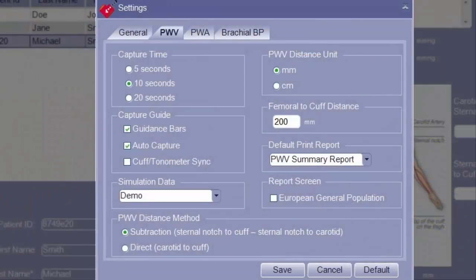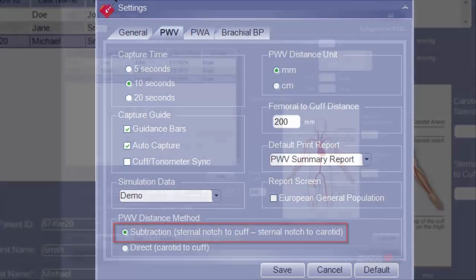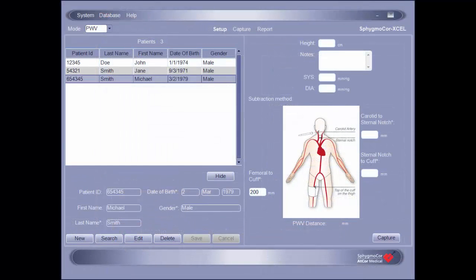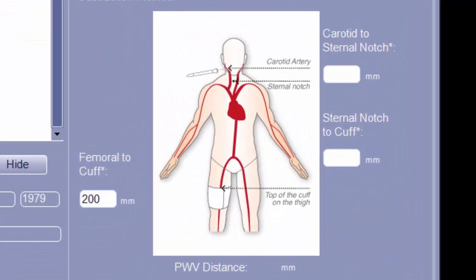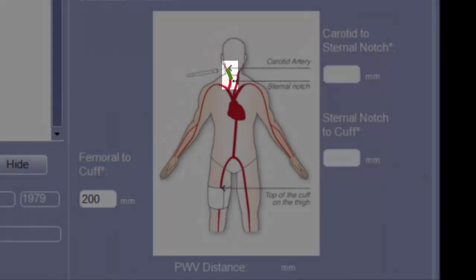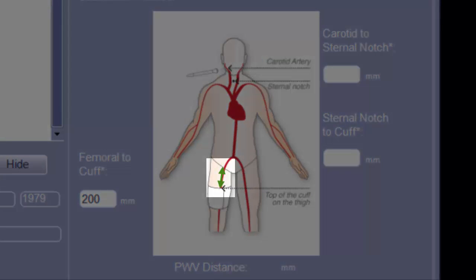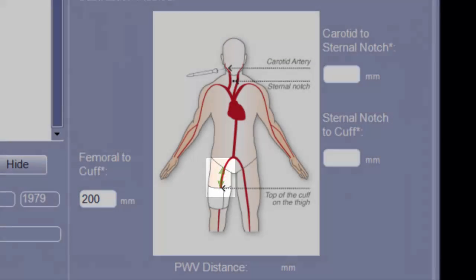The SphigmaCore XL allows for multiple distance measurement methods. In this tutorial, the subtraction method will be demonstrated. Three separate distance measurements are required prior to data capture: the distance from the suprasternal notch to the mark made over the carotid pulse; the distance from the suprasternal notch to the top of the thigh cuff; and the distance from the femoral pulse to the top of the thigh cuff.